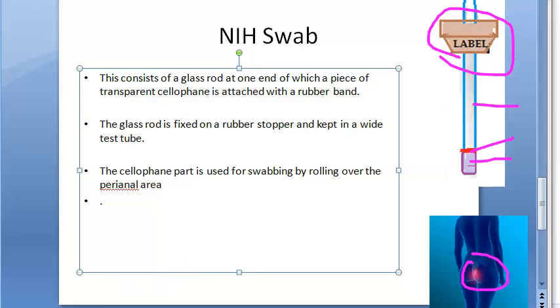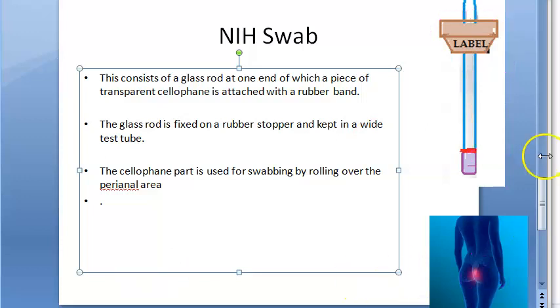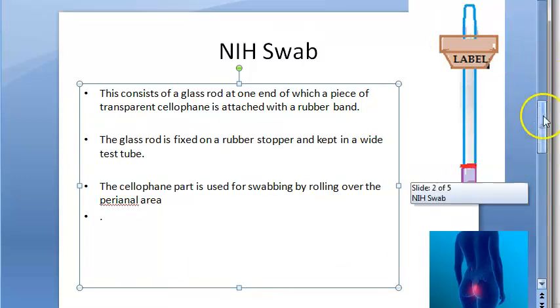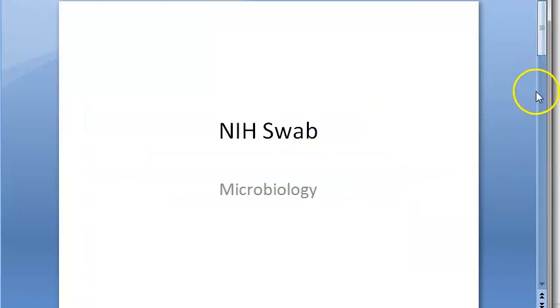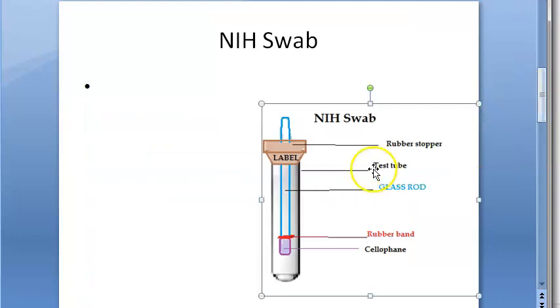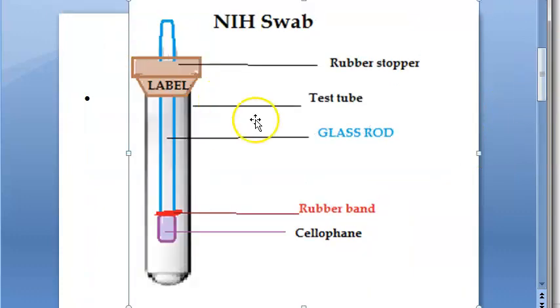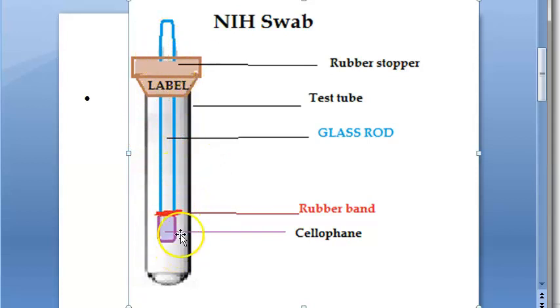After swabbing, you keep it back in the test tube. The entire glass rod with the cellophane and rubber band goes into this test tube. You remove it, swab the perianal area, then keep it back in the test tube.